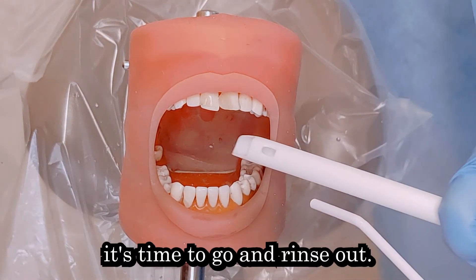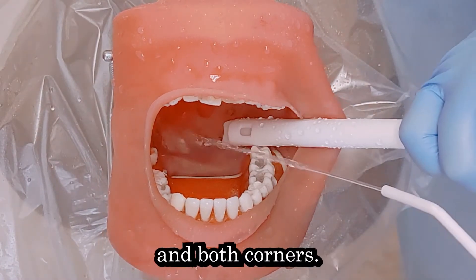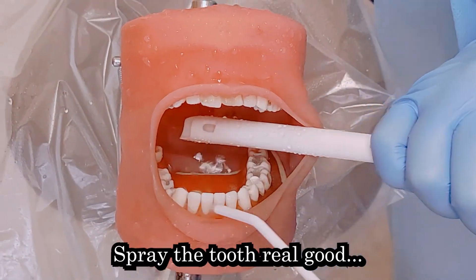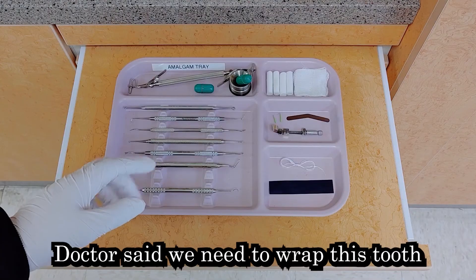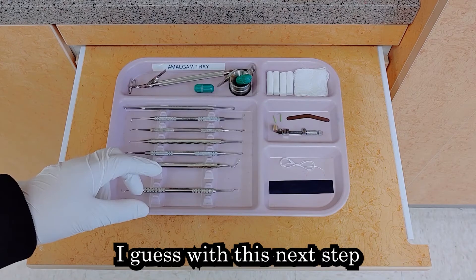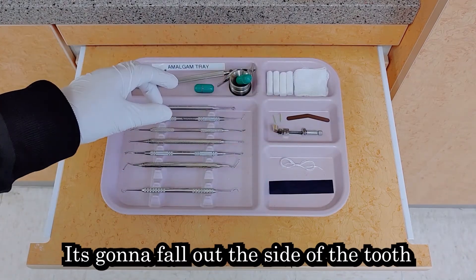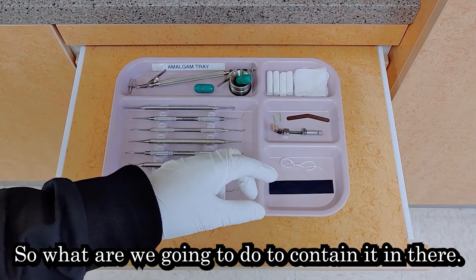Doctor's done drilling, so I guess it's time to rinse out — get all those little bits in the back on both corners. Spray the tooth real good. Now this is the very beginning. Doctor said that we need to wrap this tooth so that the filling doesn't fall out the sides. If we pack any filling in there now, it's going to fall out the side of the tooth.